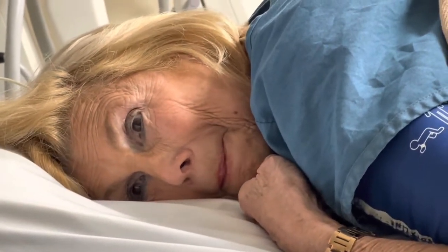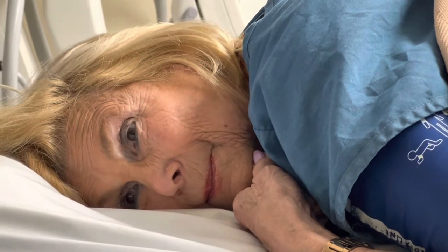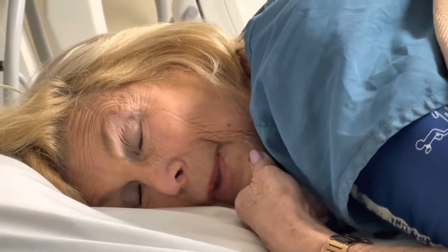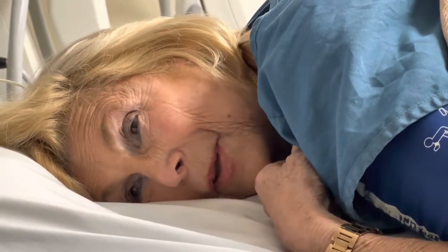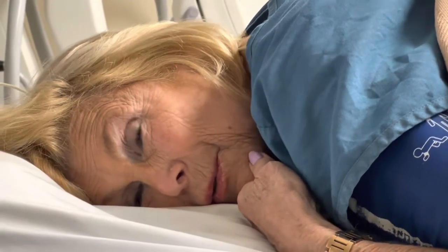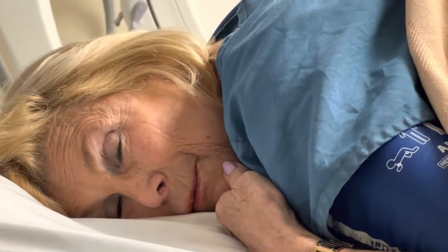And that's the way you felt even this morning when you came in? This morning was really good. So we've had the kyphoplasty. We put in about almost three and a half cc's of cement. How bad was that procedure? They made me very comfortable. But we didn't use any sedation or anything, did we? No. We just numbed you up a little bit. Did you have much pain with the procedure? No.